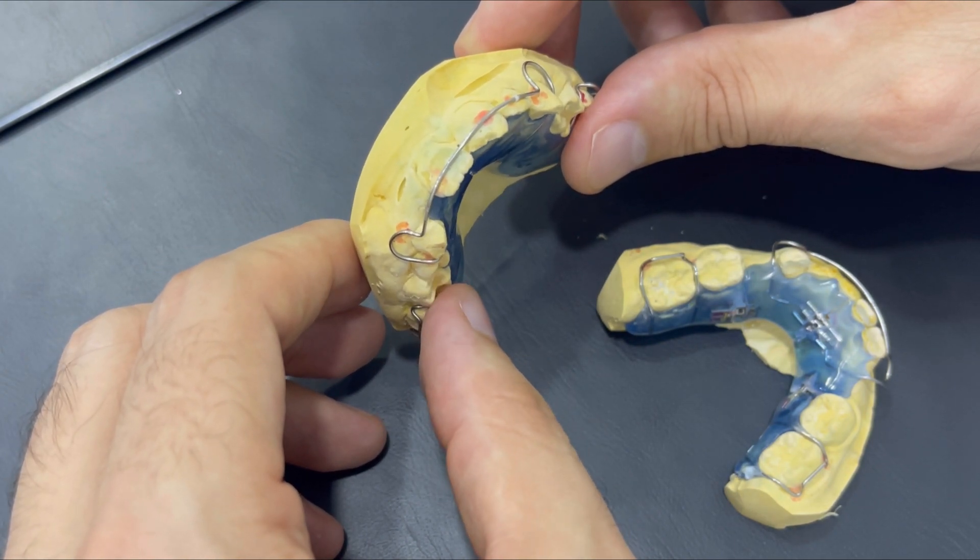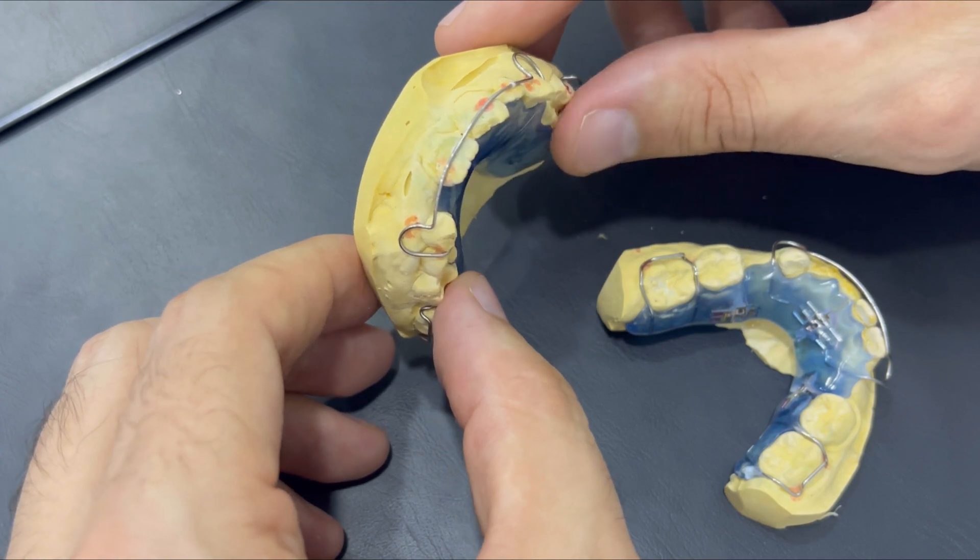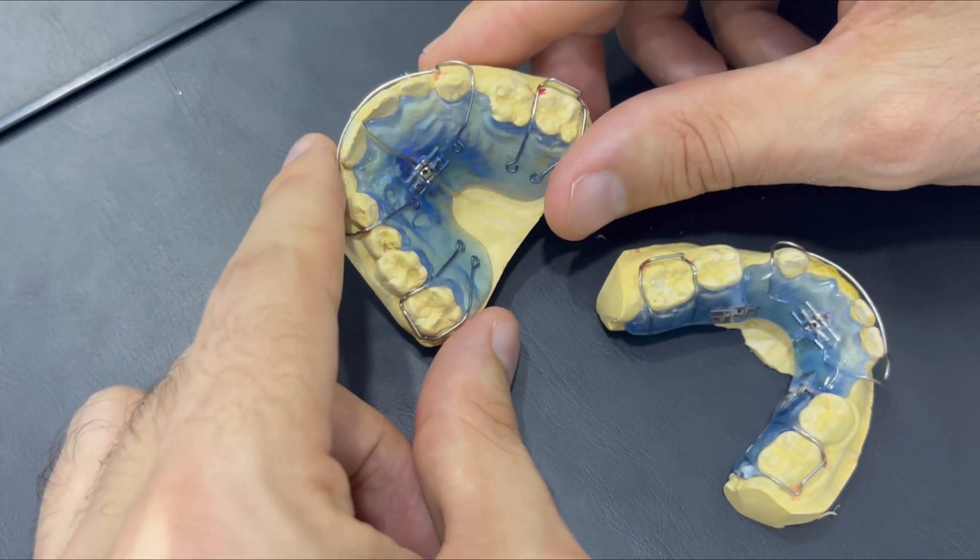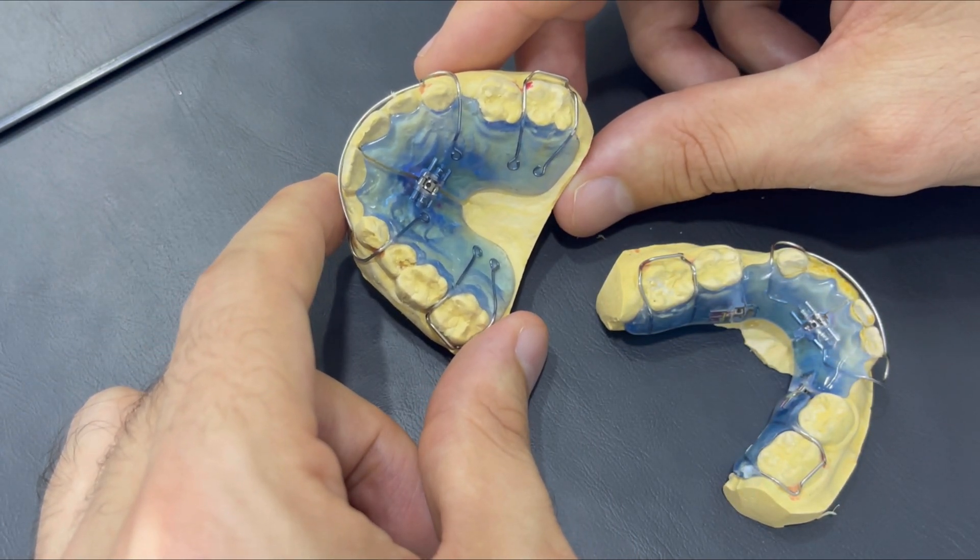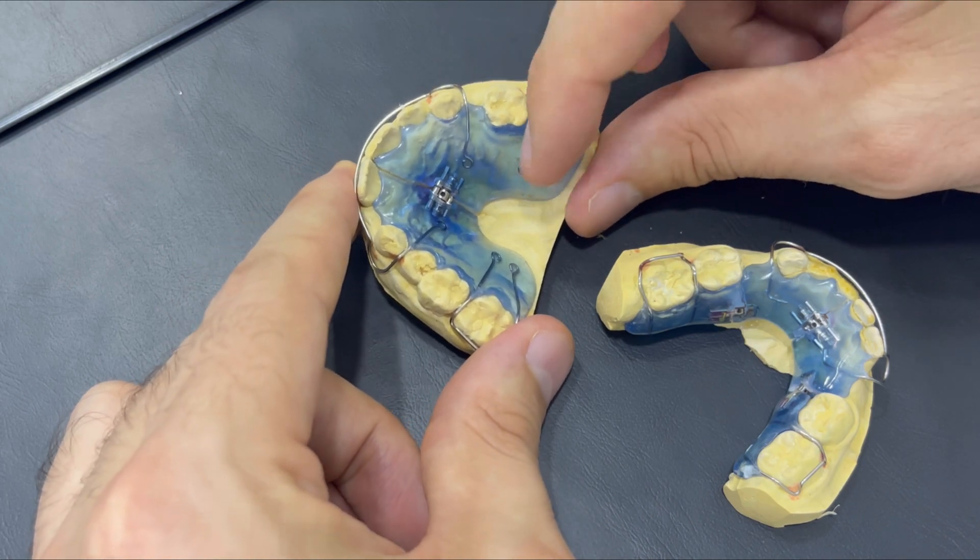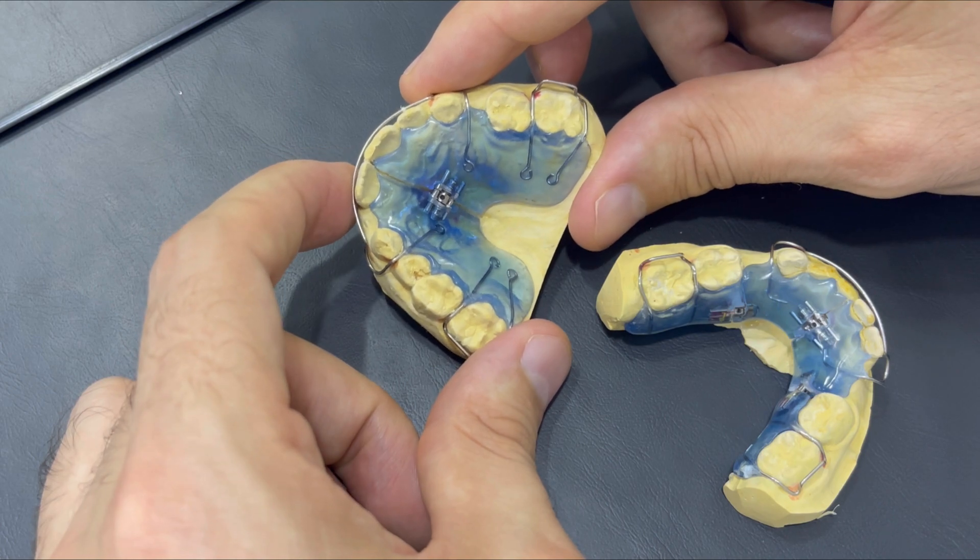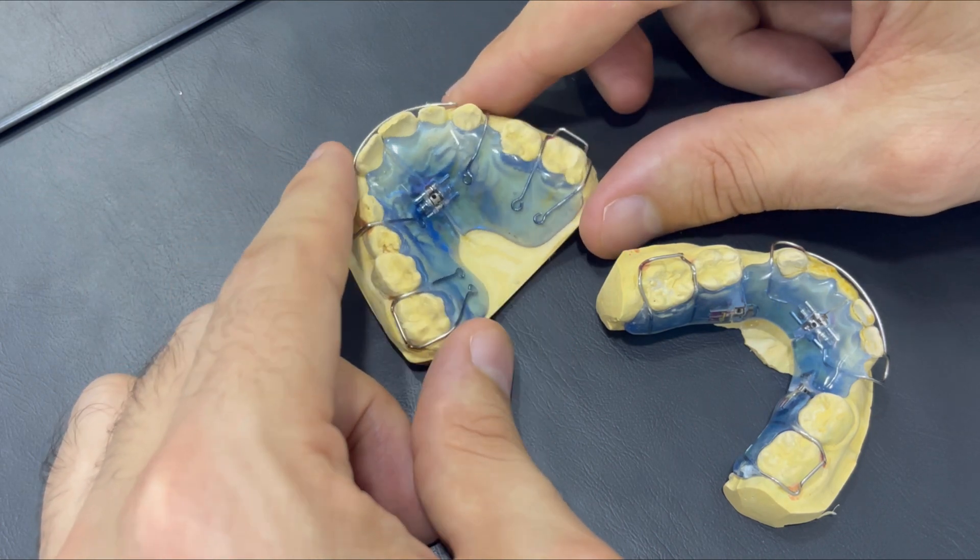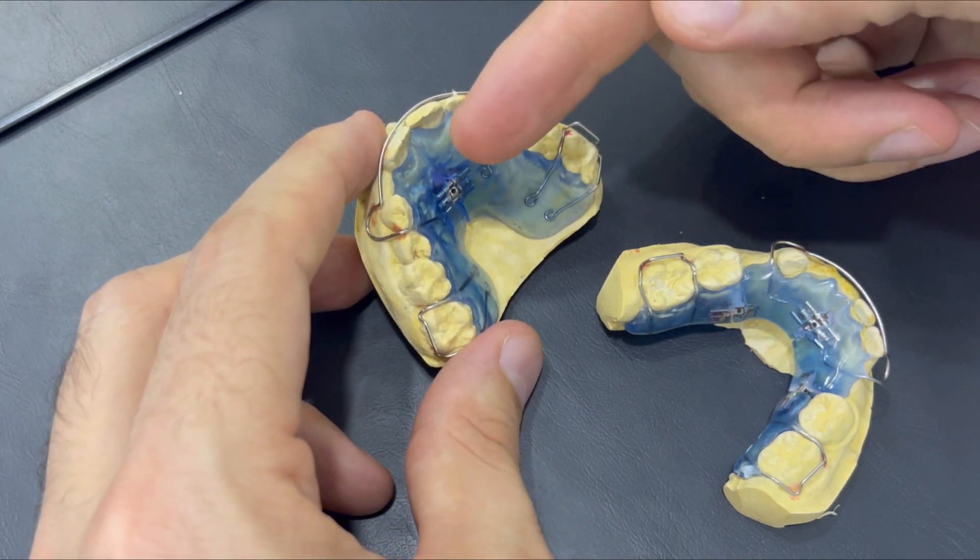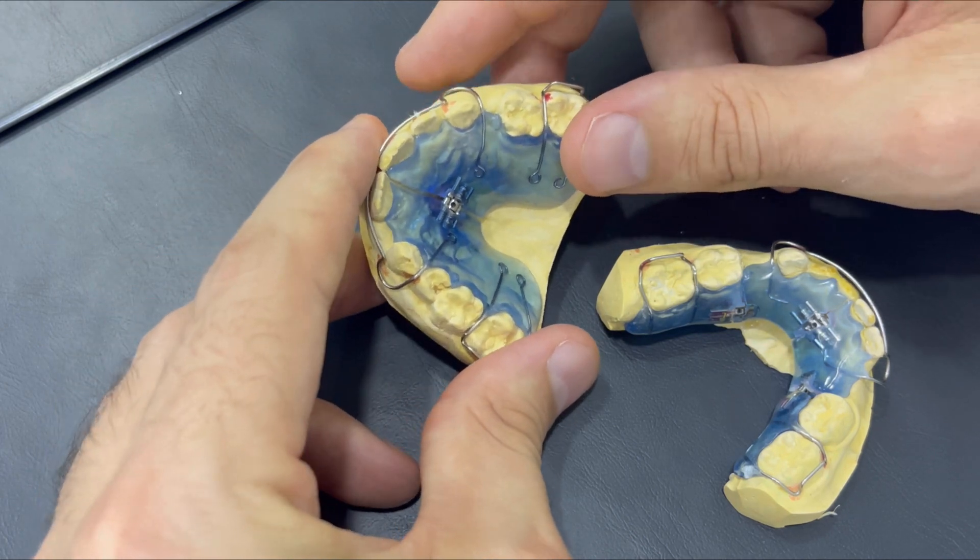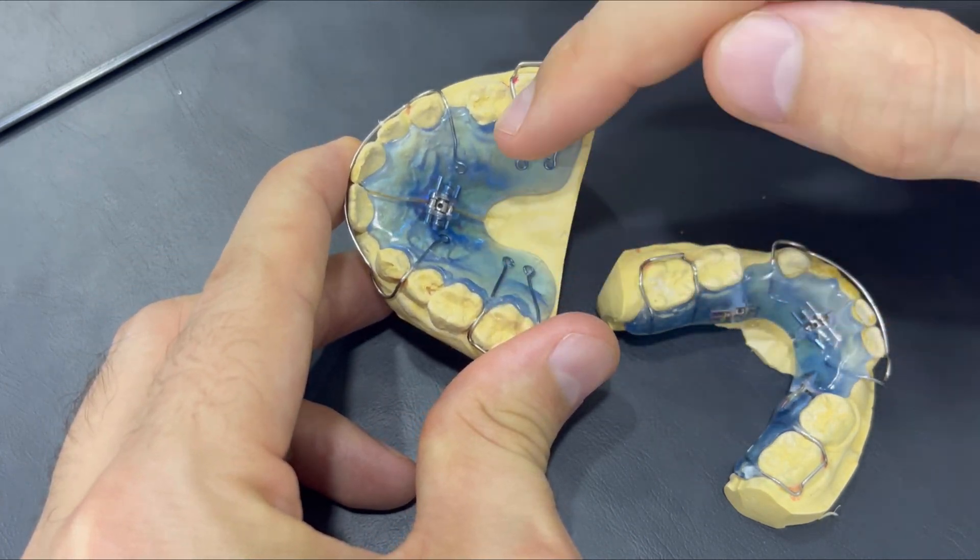Sometimes it's useful to incline the teeth outward if they are already inclined inward. The body of this device is designed to deliver horizontal forces to expand the teeth and using this screw to activate it.